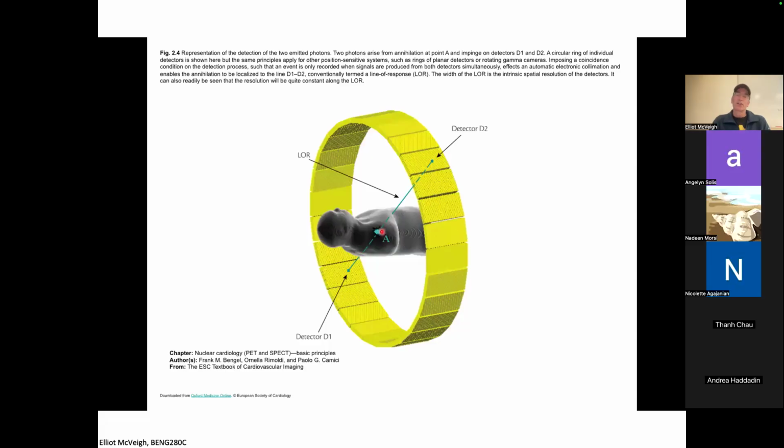So here's the essence of the high spatial resolution for this technique. Just like in SPECT, we're going to have detectors and a detector array around the patient. And this 500 keV photon will interact with a crystal in the detector and cause a flash, okay? And the detector material is special such that it's tuned to interact with high energy photons up at 511 keV. And recall, we have a positron emitted here, hits an electron, two photons come out simultaneously.